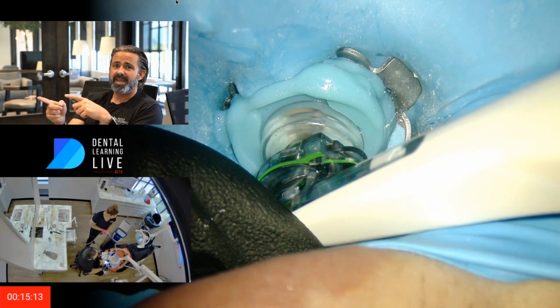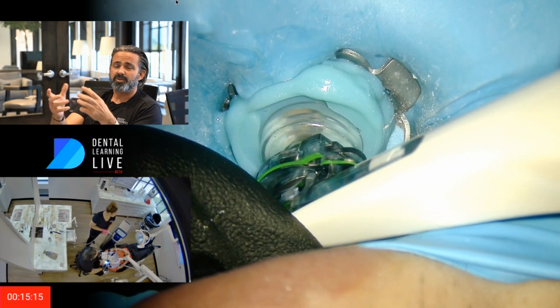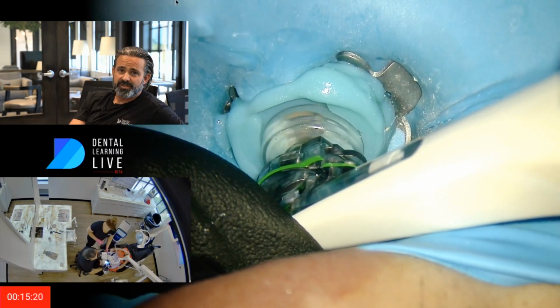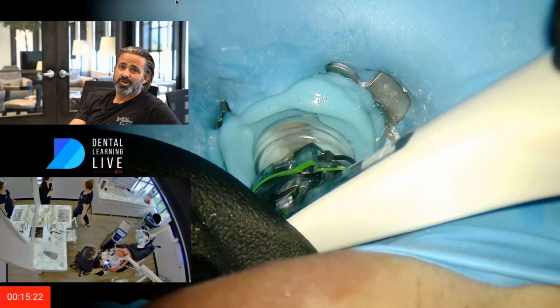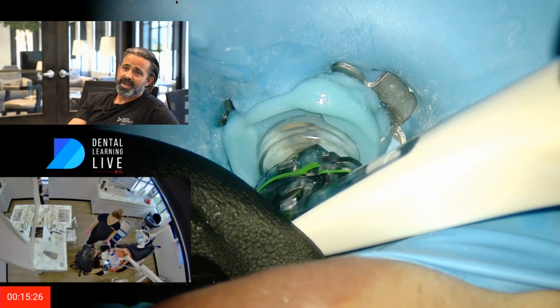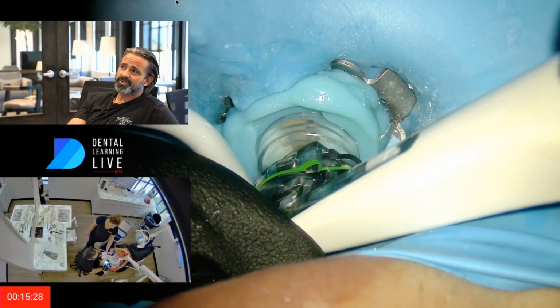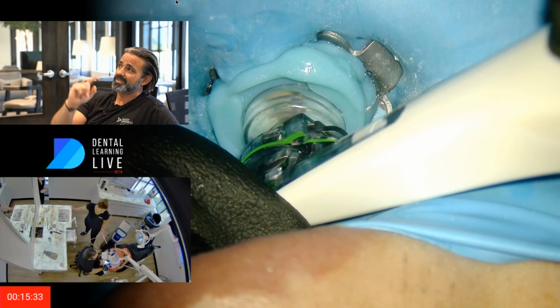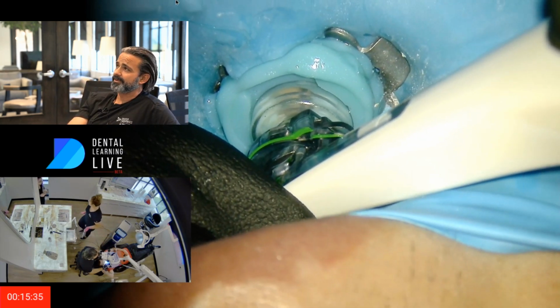So when it comes to apical periodontitis, you'll see kind of this sort of intrusion or extrusion, depending on your perspective, of what's going on in the supporting tissues. And in this case, it looks like bleeding, and that's what's happening into this. As I've been talking, 15 minutes, 31 seconds has gone by in the treatment.